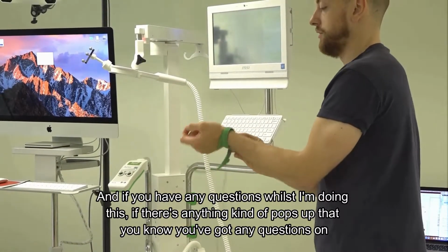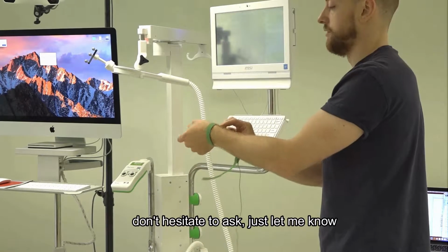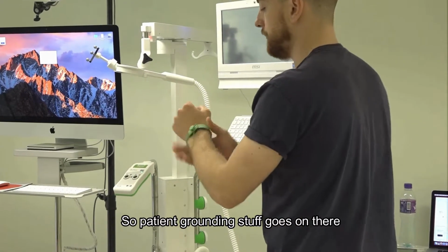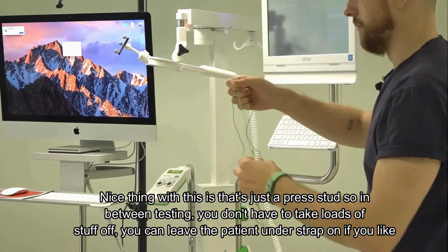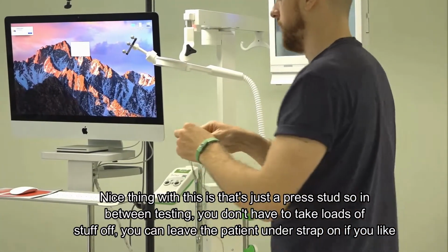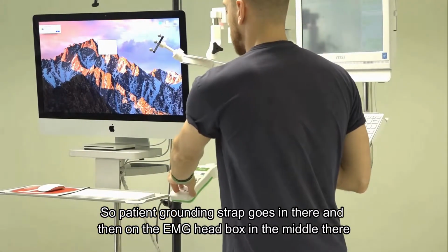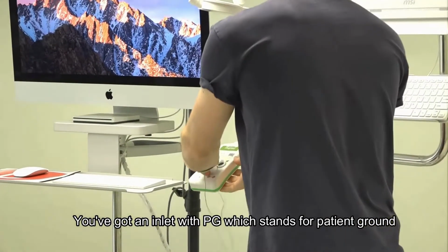If you have any questions while I'm doing this, don't hesitate to ask. Just let me know. So the patient grounding strap goes on there. The nice thing is that it's just a press stud, so in between testing, you don't have to take loads of stuff off. You can leave the patient grounding strap on if you like. The strap goes in, and on the EMG head box in the middle, you've got an inlet which says PG, which stands for patient ground. So that goes in the middle.